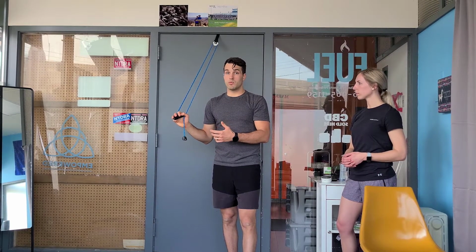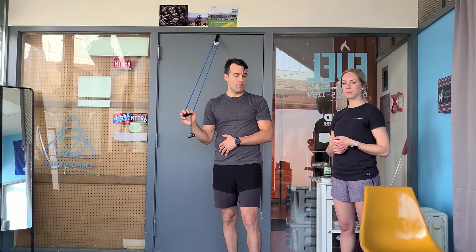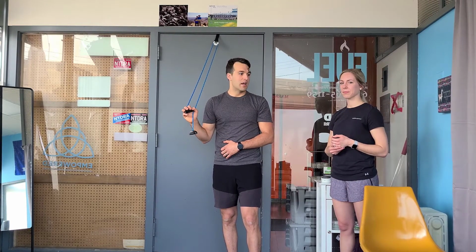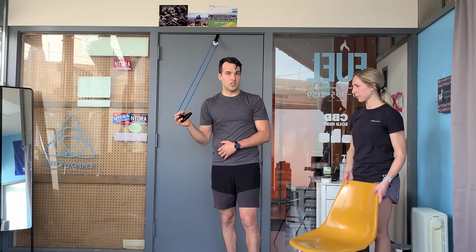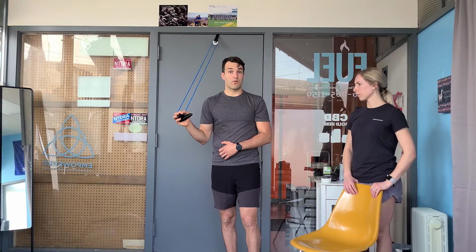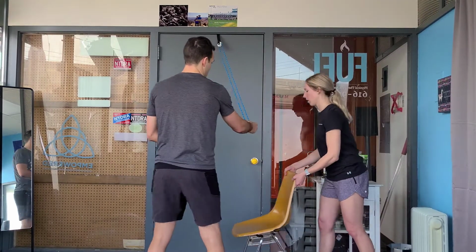If you have more range of motion and you're able to reach over your head, sitting is a better way to get more of that range of motion and get your arm up over your head more. I'm limited right now to about 90 degrees, so standing works just fine for me. Now Haley's going to show you how to work abduction and then some behind the back too, which can be pretty helpful if you're in the later stages of surgery working on that end range of motion, or even if you have a frozen shoulder and you're having a tough time reaching behind your back. So Haley, can you go ahead and show?